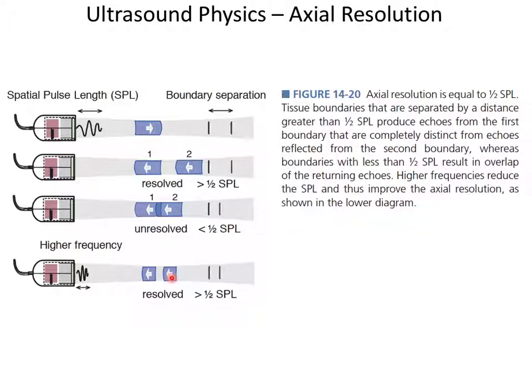It's not used commonly, but it's a product that's available, which is intravascular ultrasound, where you put a catheter with an ultrasound transducer on it into the artery that has the lesion, and you look at the lesion with ultrasound, like millimeters away from it. It's pretty cool.